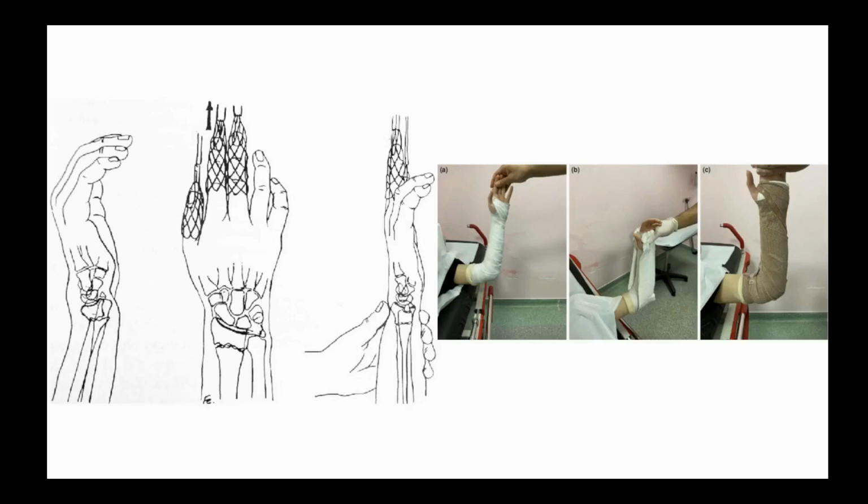Here's one example of how you might reduce a distal radius fracture. On the left side of the screen here, you're seeing the finger traps. Essentially what you do is you put the hand in finger traps and you have it at elevation. So this is held above the patient's head, and gravity is helping to reduce the fracture here. And usually, which is not pictured, down at the elbow, you'll have some weights hanging on the patient's arm, so it's under tension. And you may still have to reduce the fracture manually, but gravity can be your friend here to pull this back into some anatomic traction.